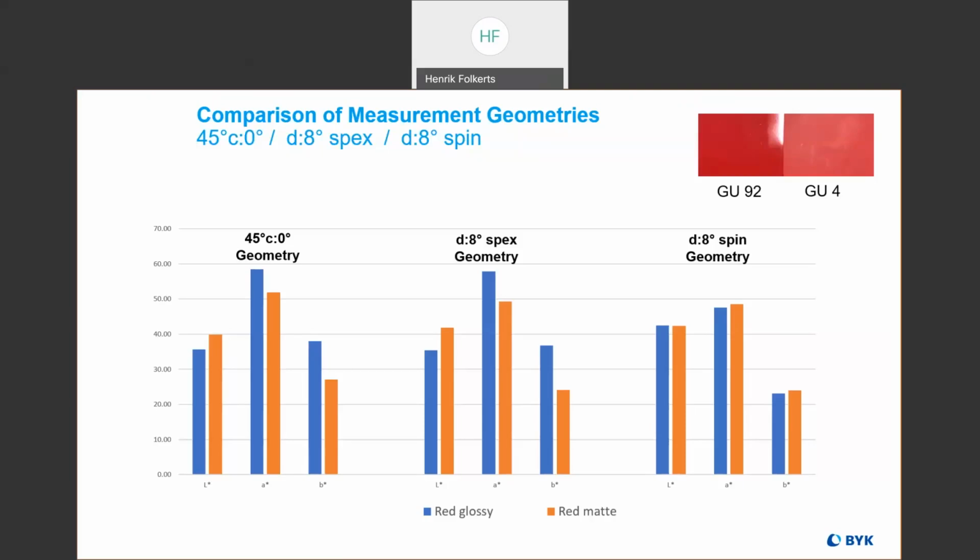And teeth are translucent. So you have to have either a consistent covering or some type of consistent backing. So you either want to put some type of black, we have a black cup or a black trap you could put over the instrument to block out any light that would affect the measurement too.